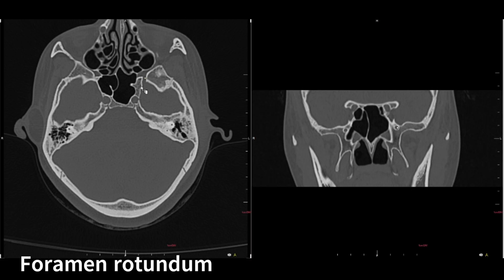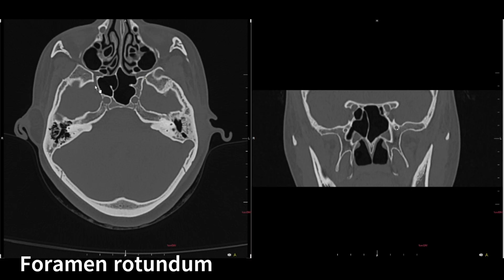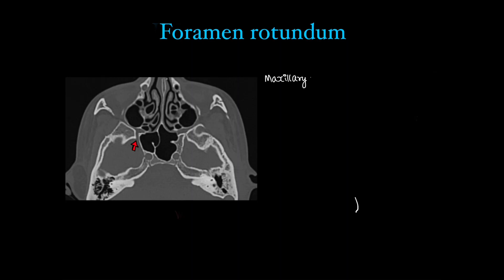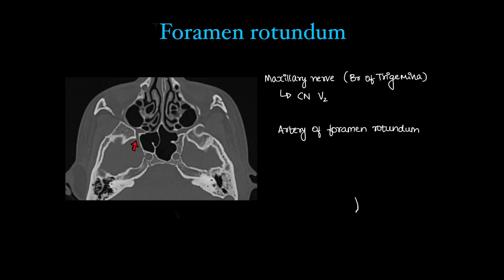It runs anterior to posterior, so on coronal you can see the cut section as circular. Contents of the foramen rotundum: the maxillary nerve, which is the second segment of the trigeminal nerve (V2); the artery of the foramen rotundum; and emissary veins running through it.